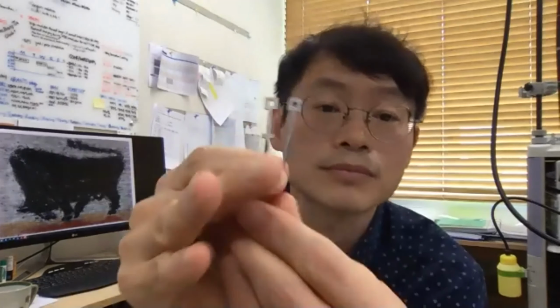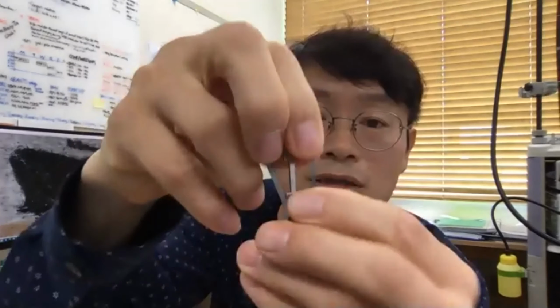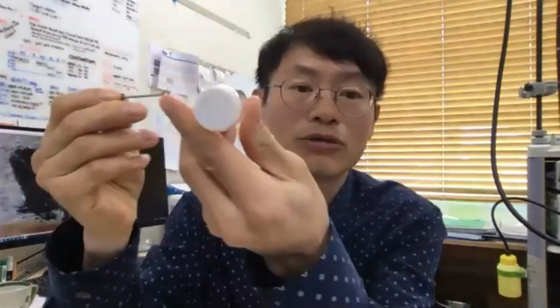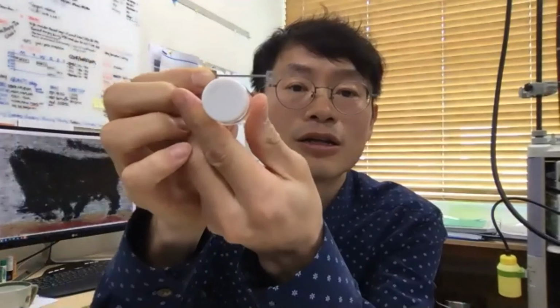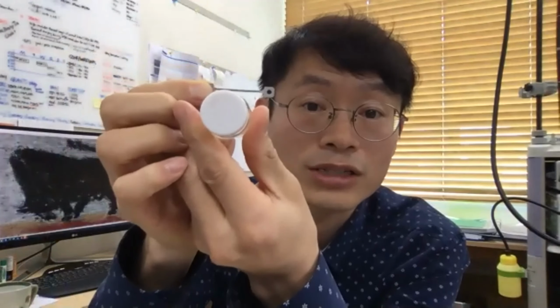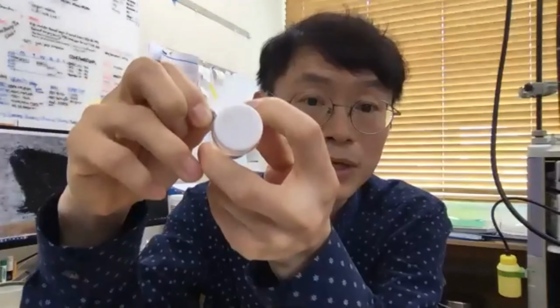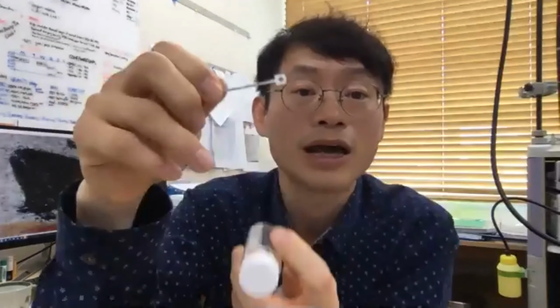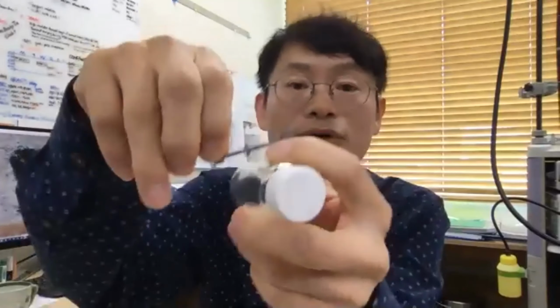Keep the body temperature warm so as to keep the physiology. Another example I brought is these, also called head bars. How do you use it? Let's say this is the mouse brain and window. You get the head bar fixed to the skull so that later you can use this head bar to grab it during the imaging. Sometimes this is not strong enough, so you create these ones.